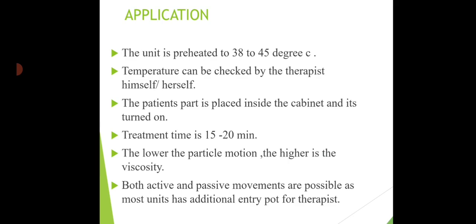Even the therapist can insert the hand from one side and do passive movements along with the treatment given by the fluidotherapy modality. So this is one of the benefits of the fluidotherapy equipment. This is what I was talking about. Here, as you can see, the patient or the model is here, and the therapist can also insert the hand and help in doing passive movement during the therapy.